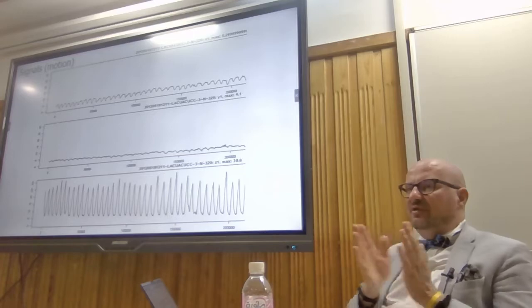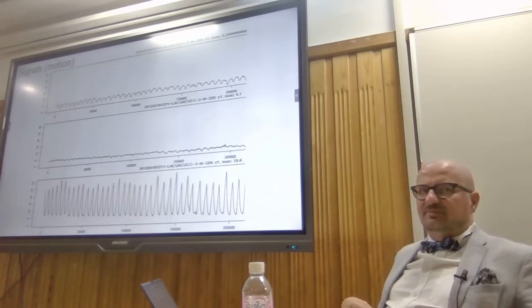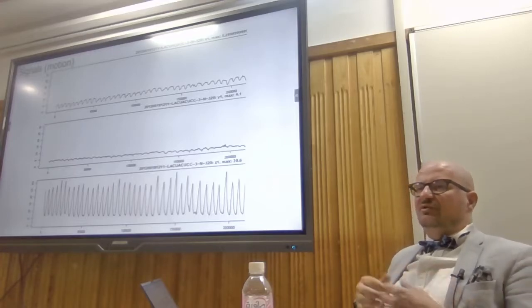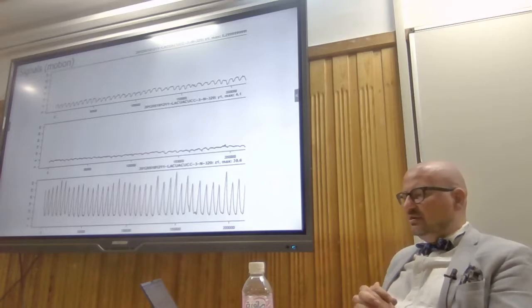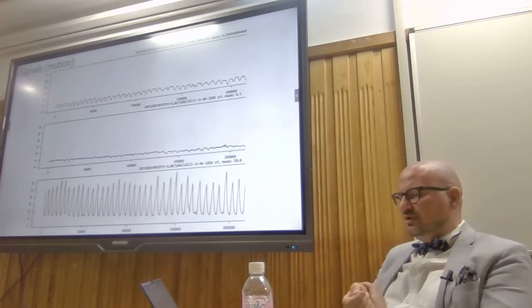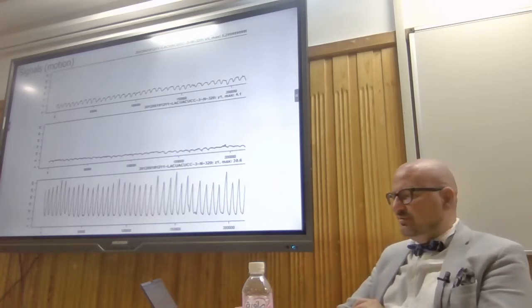If you look at the motion to the sides, it becomes important only if your target is on the sides of the body. If it's somewhere near the top, it's less. But up and down, it could be really a lot. So here, for example, it's something like 25 millimeters, maybe even 30 millimeters.